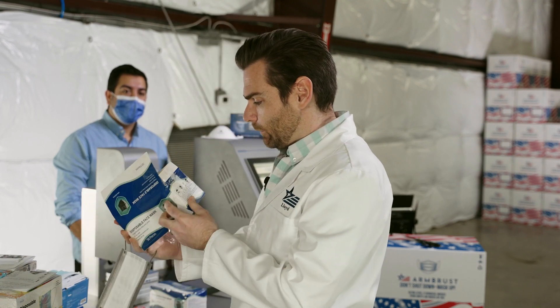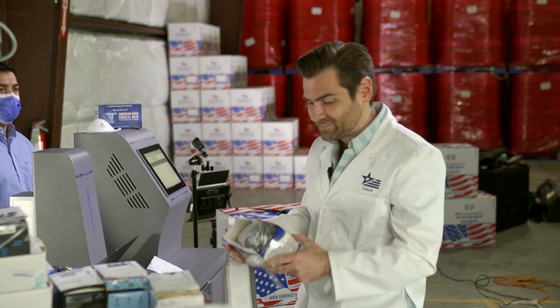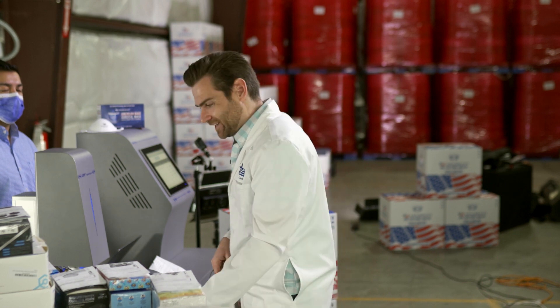Let's take a look and see if they're making any claims on the box about this particular mask. It doesn't look like it — it's just saying it's a disposable face mask. But it does say it's four ply. That's got to be a typo.